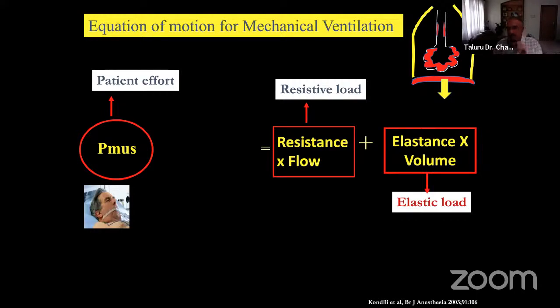Whenever the pressure goes up for a set volume that is being delivered, say when we start ventilation, we are giving a 6 or 7 ml tidal volume and your plateau pressure was 14, and with pneumoperitoneum it goes up to 20. Now you have to make a decision whether the problem is the alveoli or the chest wall. As we know, it suddenly happened because of a volume being put into the abdomen. We presume it is mostly because of the chest wall contributing to the rise in pressures. Sometimes there may be both.